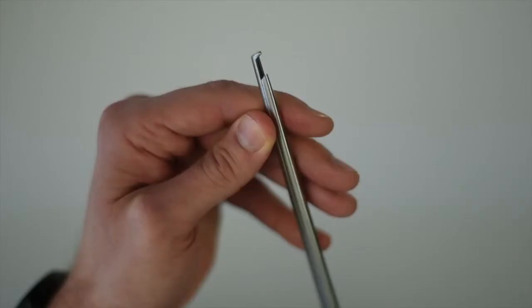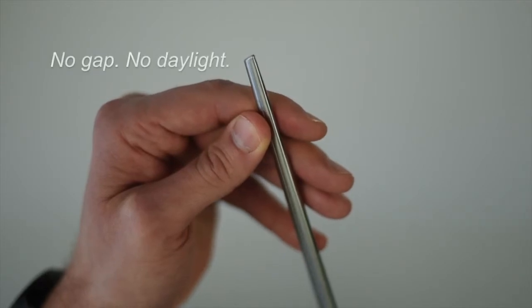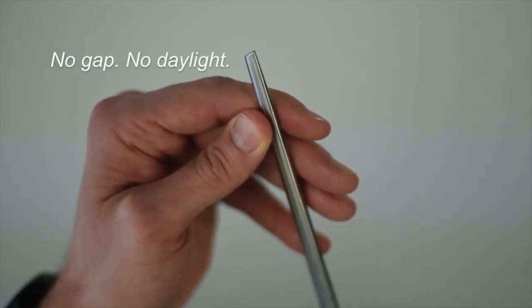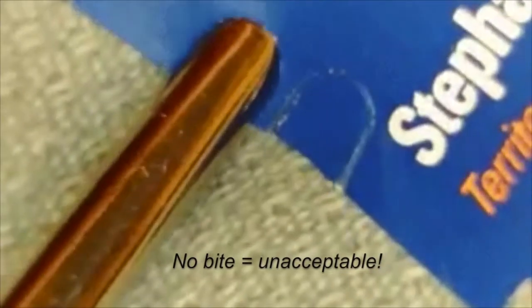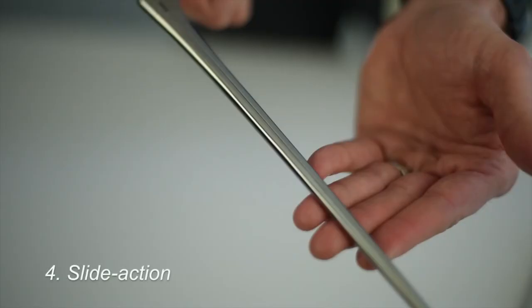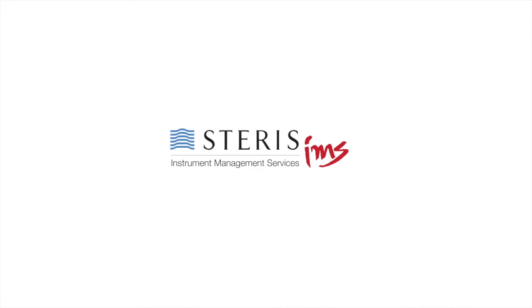When you pull the trigger, the footplate as well as the slide need to meet at the top. If there's any gap there or any damage to the edge on either side, it's dull and needs to be set aside for repair.